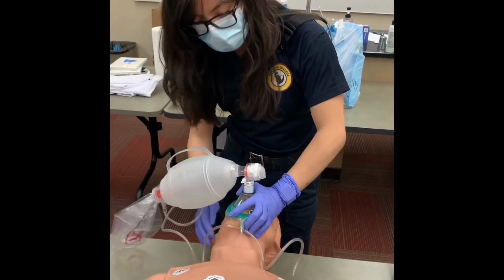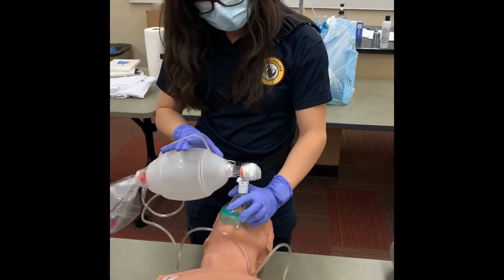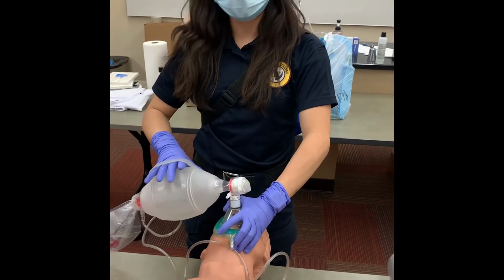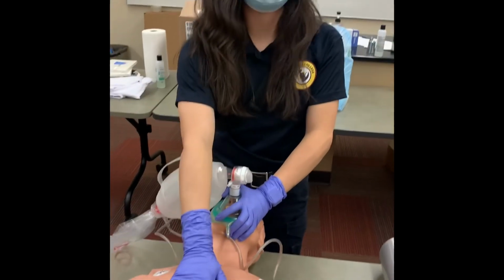Okay, so I'm gonna go ahead and recheck for a pulse. Patient is still apneic and has a weak pulse. Okay, so I'm gonna continue giving ventilations and on the way to transport, so I'm transporting immediately. And how do you know if you are delivering appropriate volumes with each ventilation? So I see proper chest rise and fall on the patient.